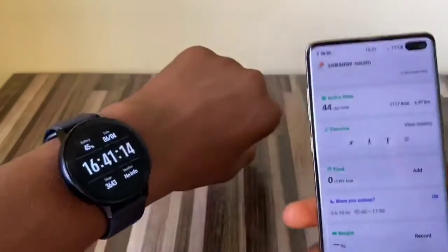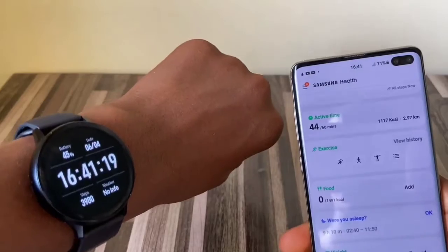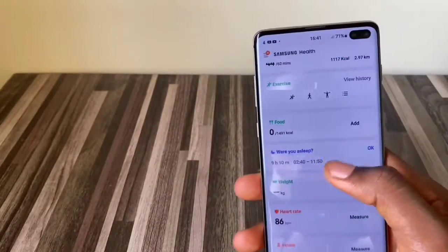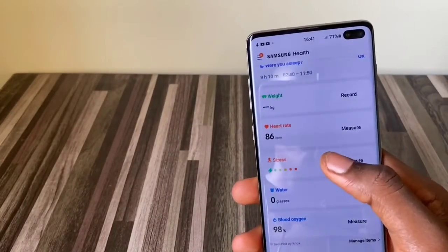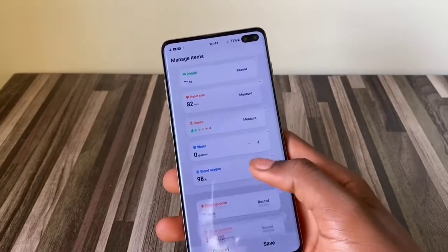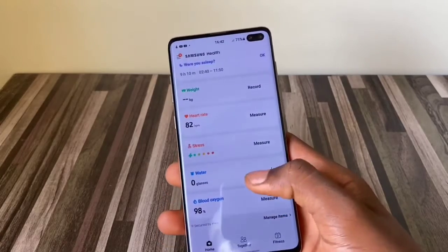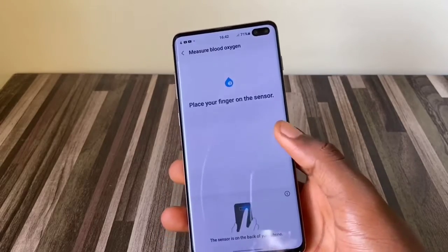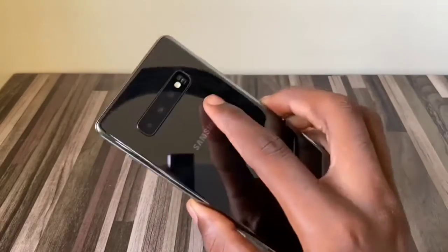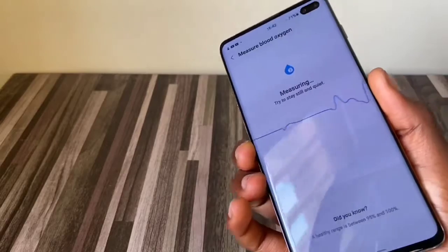Now you need to open the Health app. So when you open that, you just scroll down a little bit, then you get an option to add more or manage your items. So from here you can search for the blood oxygen option, and I have mine. When you click measure, it's gonna ask you to put your hands on the sensor, and you just do that and it measures everything for you and gives you your results.